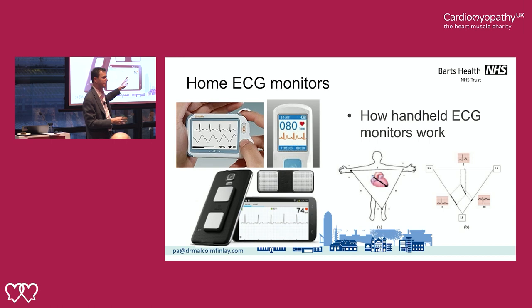And this kind of harks back to when you only have two electrodes connecting across the heart and hands. It's just the same thing that they were getting all the way back then. So there's a nice little bit of history there.